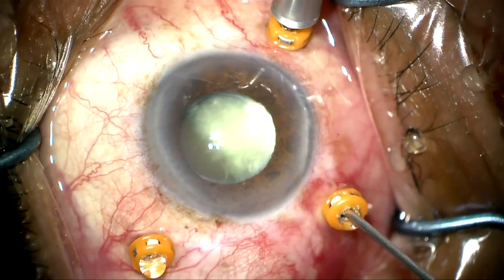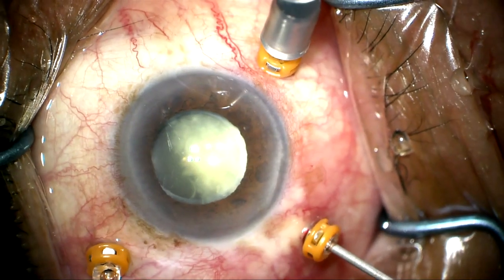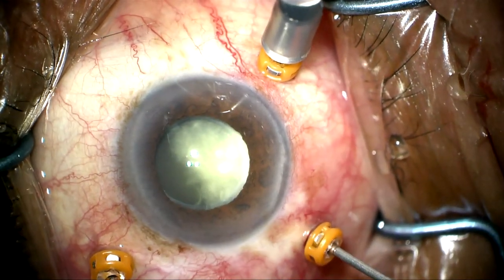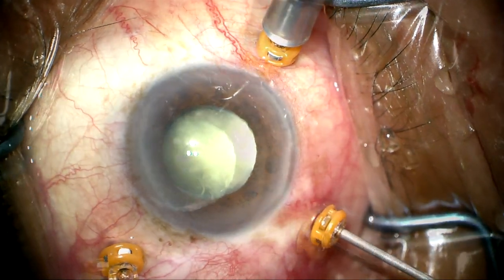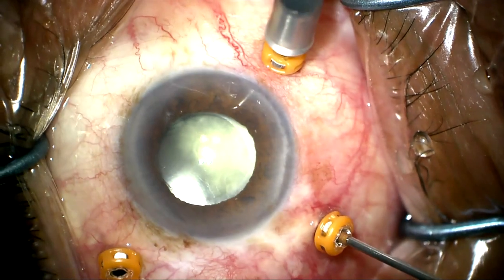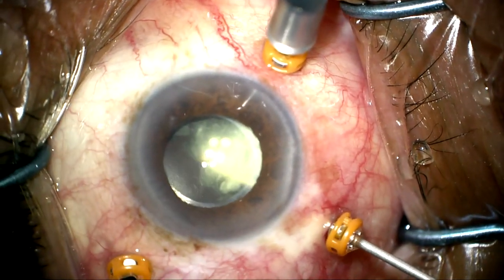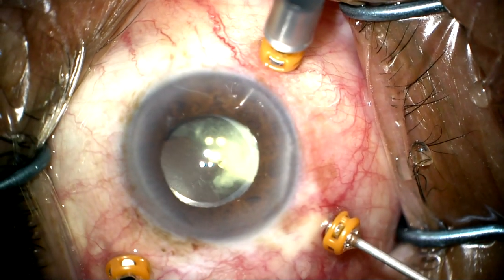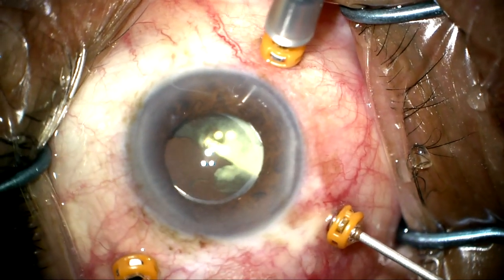Now my three trocars are in place, and I'm going to go in with the vitrector and do an extensive anterior vitrectomy to remove all of the anterior vitreous prior to puncturing the capsular bag. This is edited a little bit. I'm going to finish my anterior vitrectomy, and now I'm going to puncture the capsular bag with the vitrector on so I can get in there and start vacuuming out this lens material.